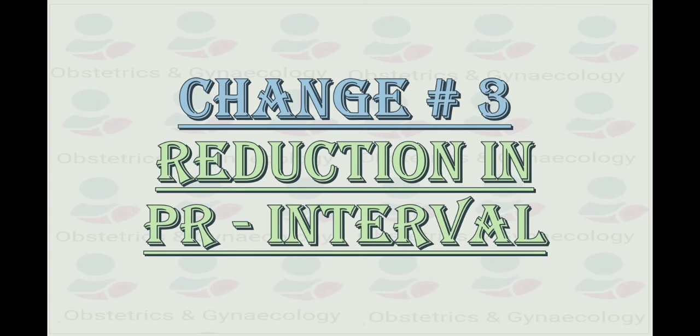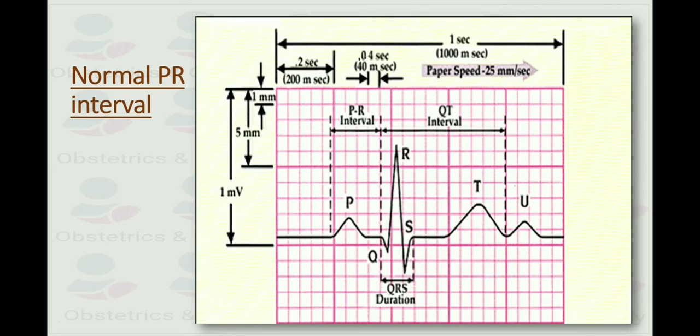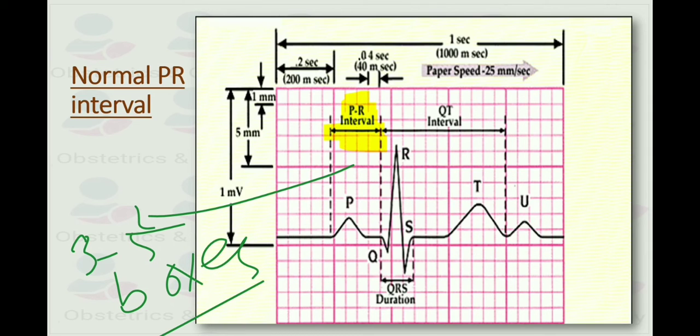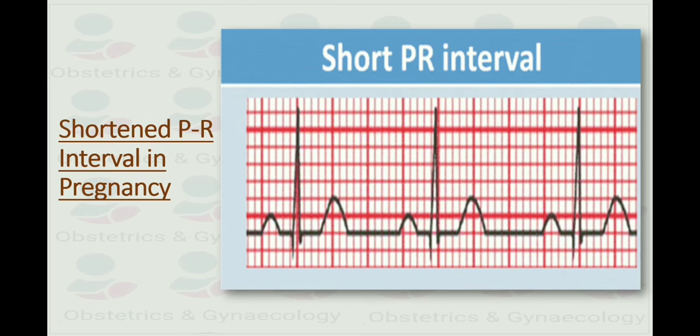Change number 3, reduction in the PR interval. The normal PR interval should be 0.12 to 0.2 seconds or 3 to 5 small squares in duration. Here you can see the normal PR interval, which covers 4 small boxes. Each small box is 0.04 second means 40 milliseconds. What happens in pregnancy, as you can see in this ECG, we have shortened PR interval. As here, it covers about 2 small boxes. So that is shortened.